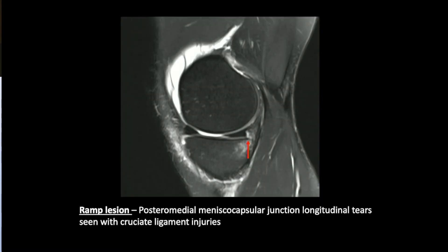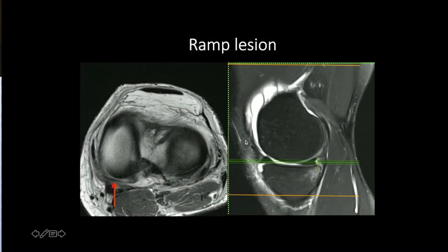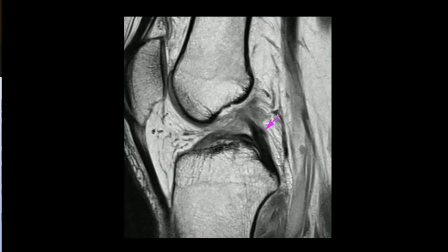There are two more longitudinal tear types common with cruciate ligament injuries. The ramp lesion is more commonly a meniscocapsular junction tear or a peripheral posterior horn medial meniscus tear. When you see a discrete fluid signal between the capsule and the meniscus, that is a ramp lesion. On actual images, the black line is the capsule, the black line is the meniscus, and between them you see a hyperintense signal — that is the ramp lesion or meniscocapsular junction tear.